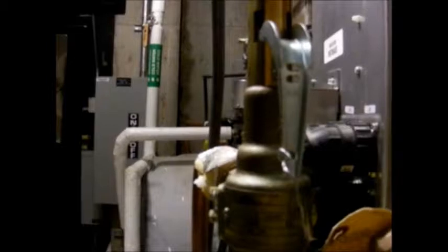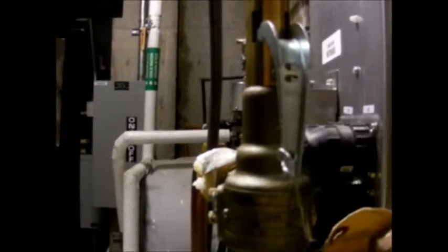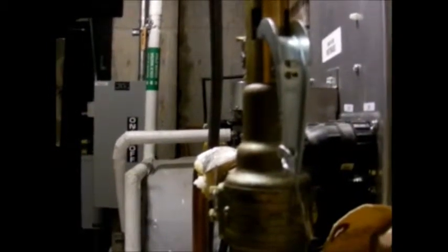This is the pop-off or blow-off valve, which is a pressure relief valve for safety and vents compressed steam into the air, which prevents damaging effects caused by overpressurization to the sterilizer chamber.